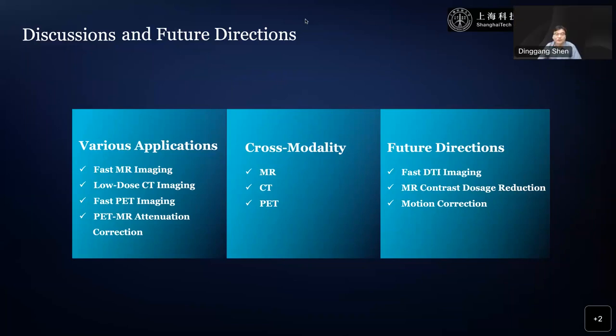Yes, theoretically. Although for all the algorithms developed, previous reconstruction algorithms like iterative optimization are just one way, and of course you have more constraints, we cannot say there is no problem with the previous methods. Similarly, with deep learning algorithms, maybe you have more unknown problems. But in our case, the result I showed is not only for research. Like I mentioned, we got FDA approval and we have already implemented this algorithm and installed it in the scanner. The scanner is already used in the US and also in China. Particularly in China, like I mentioned, for fast MR image acquisition, I gave one example.